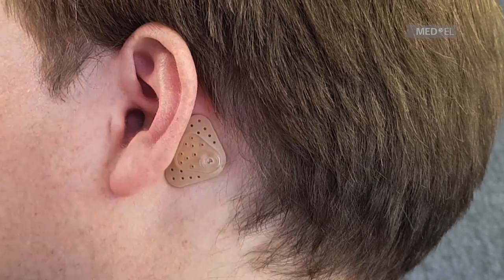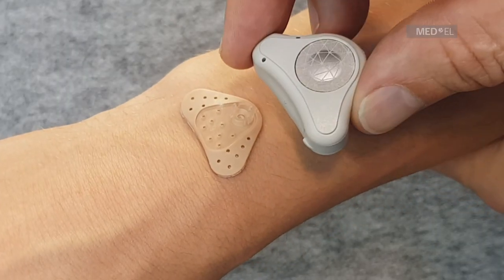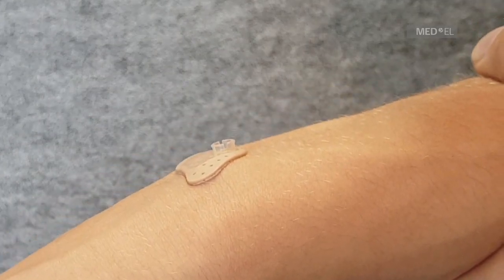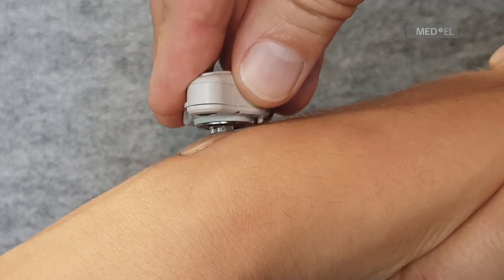Before you connect the audio processor to the adhesive adapter behind the ear, it's good to practice on a table or the back of your hand. Find the correct position and tilt the audio processor onto the snap connector while pressing down on the adhesive adapter.